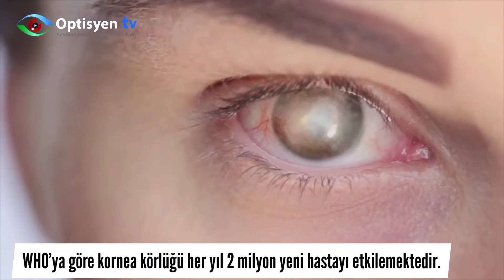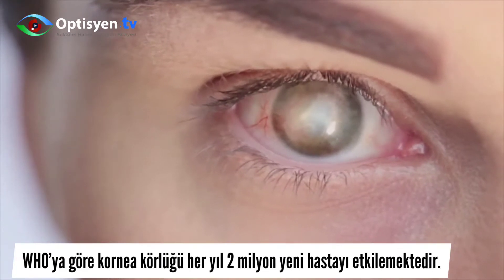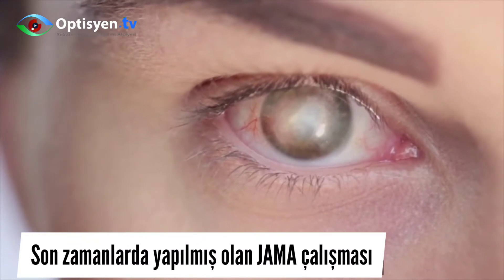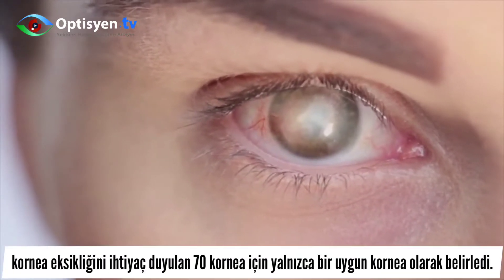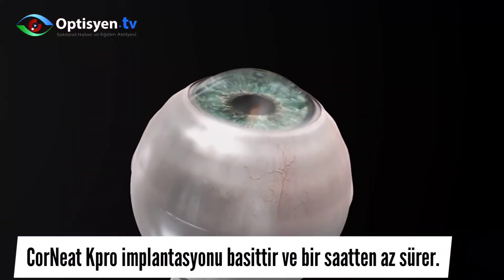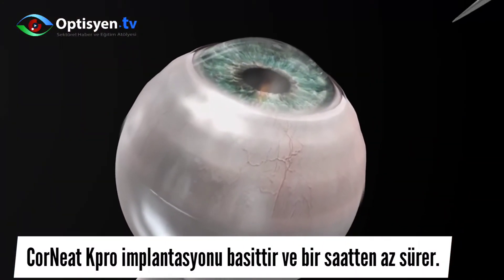Based on the WHO, corneal blindness impacts two million new patients a year. A recent JAMA study assessed the shortage of corneas at one available cornea for every 70 needed. The Corneat K-Pro implantation is relatively simple and takes less than an hour.